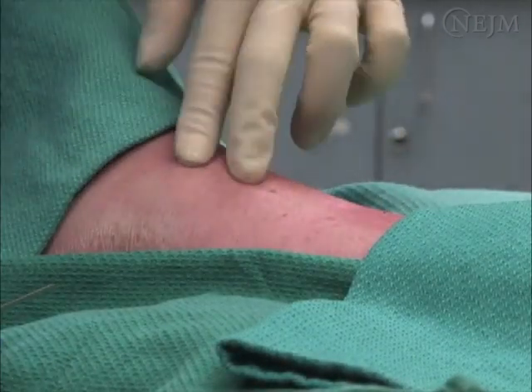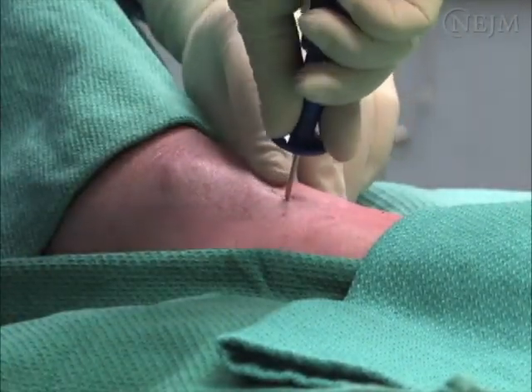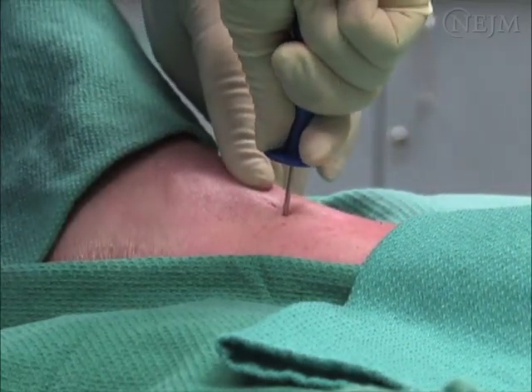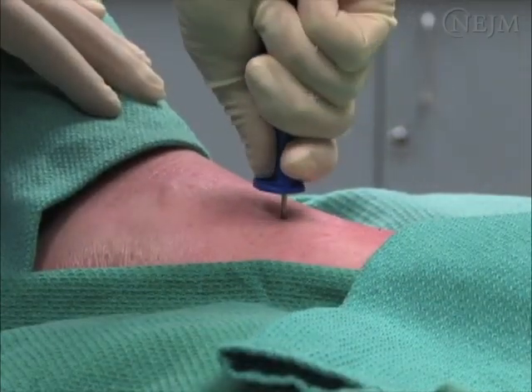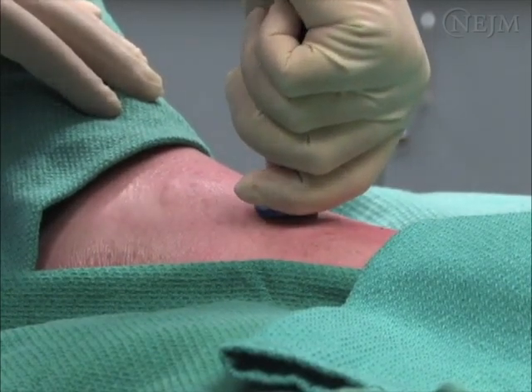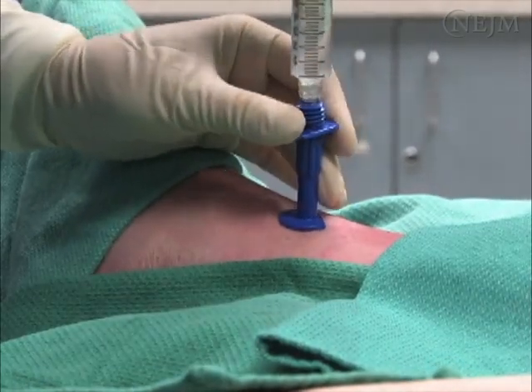Hold the needle in the palm of the dominant hand and position it at a 90-degree angle to the long axis of the bone. Advance the needle through the bony cortex with a twisting or rotating motion and steady pressure. You will encounter a great deal of resistance. A sudden loss of resistance indicates that the needle has penetrated the cortex and reached the medullary cavity. Remove the stylet and connect a 5 cc or 10 cc syringe to the needle.